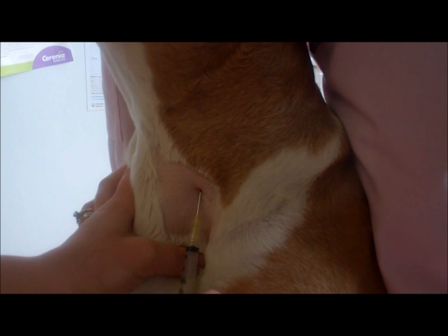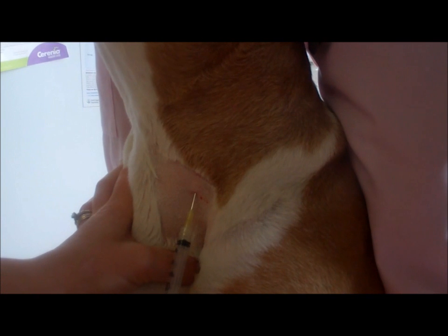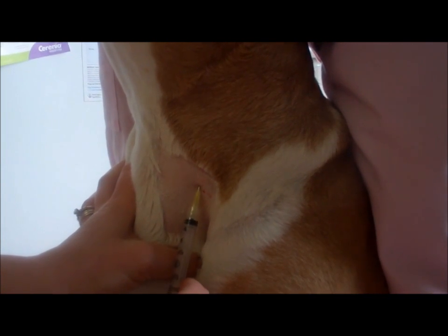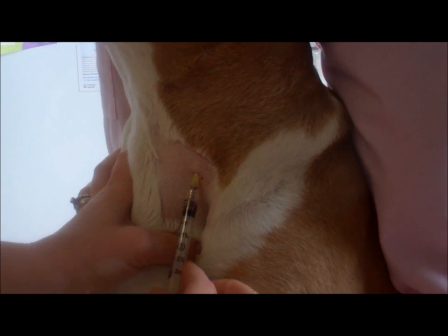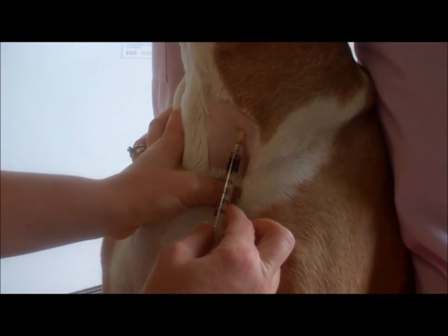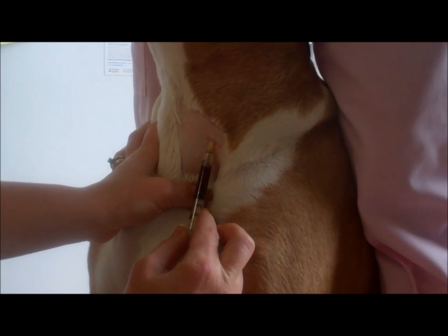You don't need to poke hard, but you do need to use some force, especially for a jugular, as their walls tend to be slightly thicker. The important part is that your fingers need to be prepared to draw as the needle slides in, and the object is not to have to redirect to get that blood.